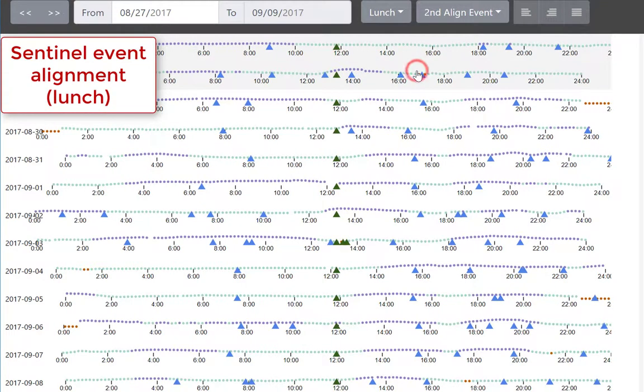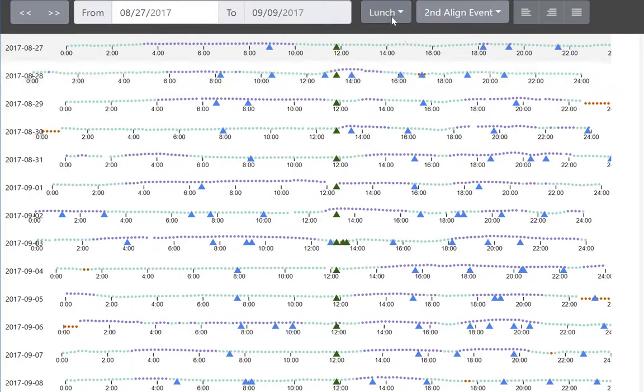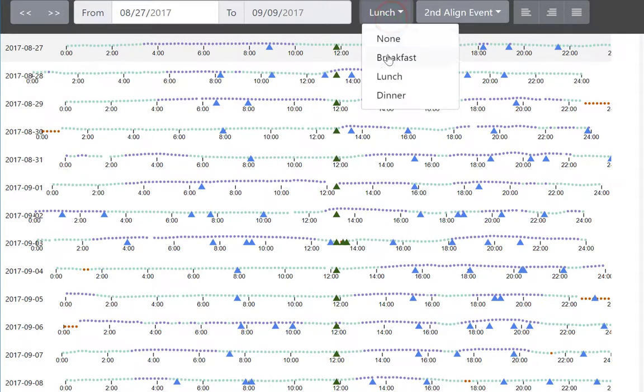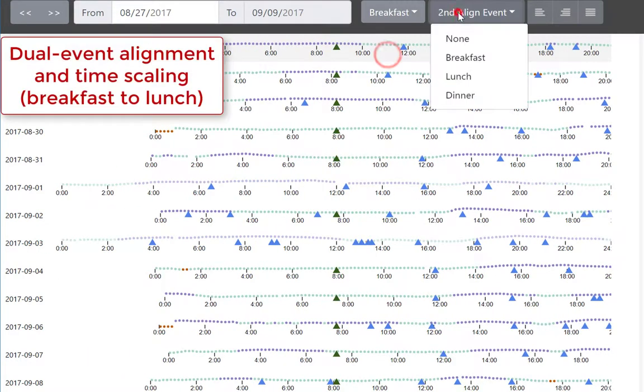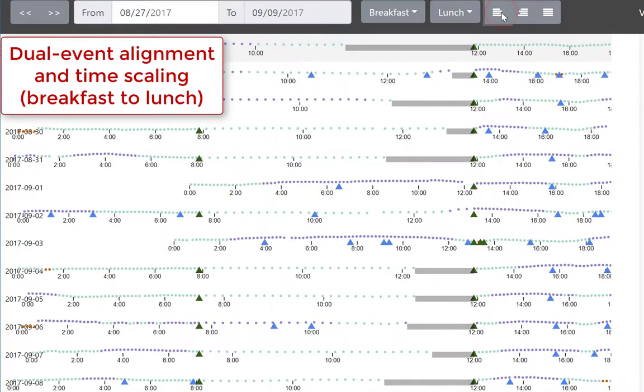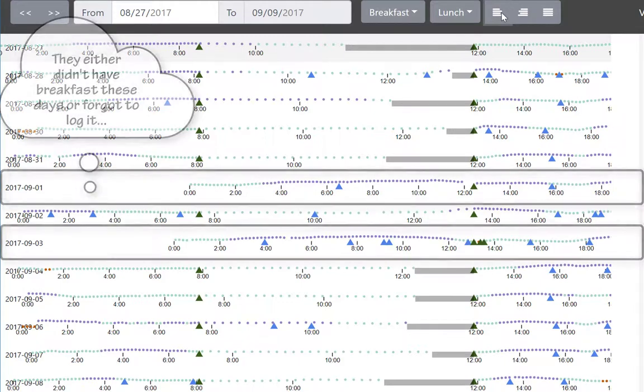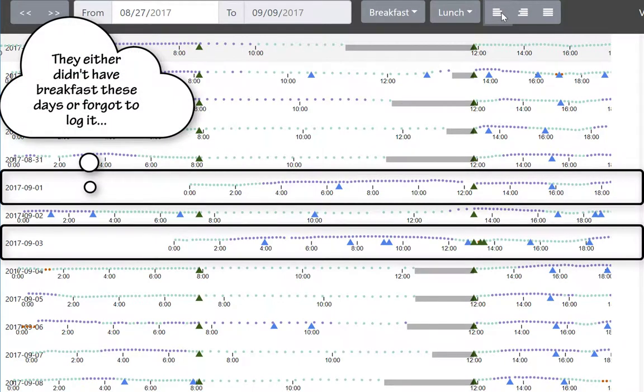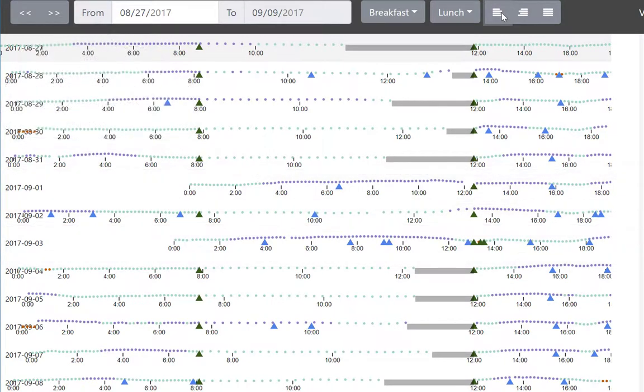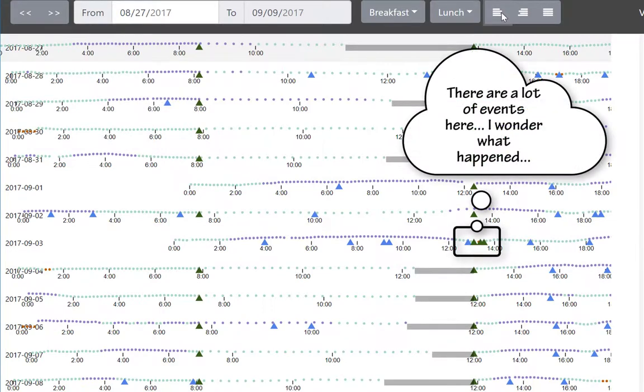Now let's align the rows using lunch as a sentinel event. We see the same high afternoon patterns. Let's align instead by both breakfast and lunch to see the interplay between them. Now we see that two breakfasts were skipped or were not logged.